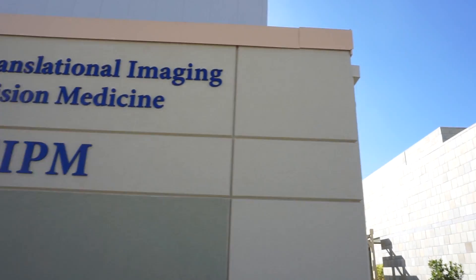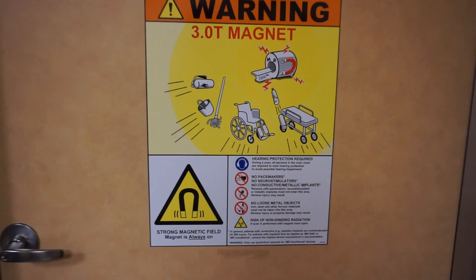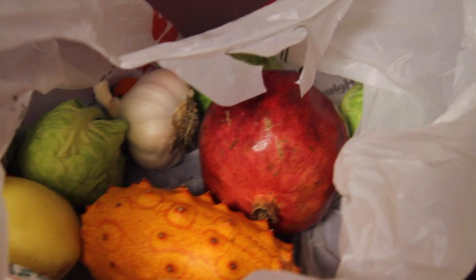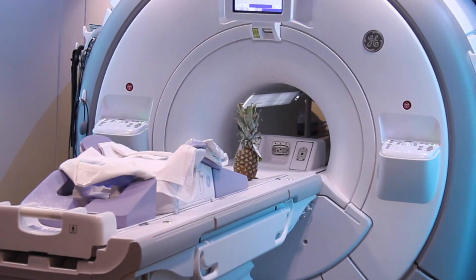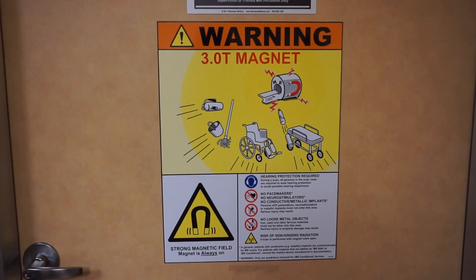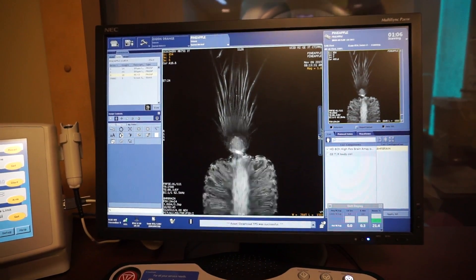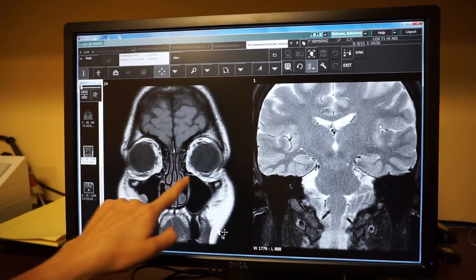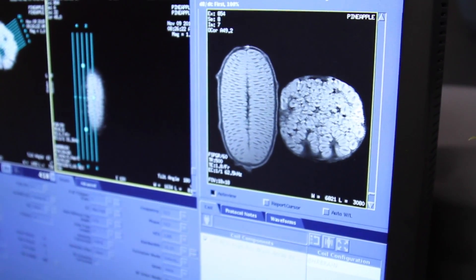I'm here with Dr. Meg Richmond at the Center for Translational Imaging and Precision Medicine at UCSD, and she's giving us the wonderful opportunity of imaging some fruits and vegetables. In our magnetic resonance imaging session, we start by putting the fruit in the center of a giant magnet. The machine is still scanning right now — the first thing we're looking for is dark and light contrast to differentiate tissues. Look at all the detail — that's amazing! That's the pomegranate next to it.